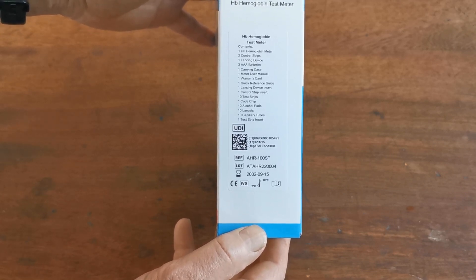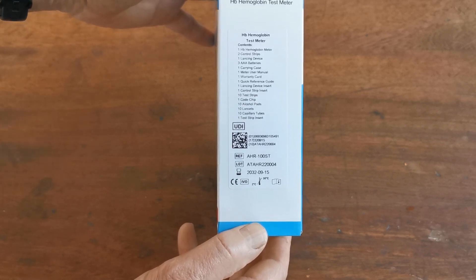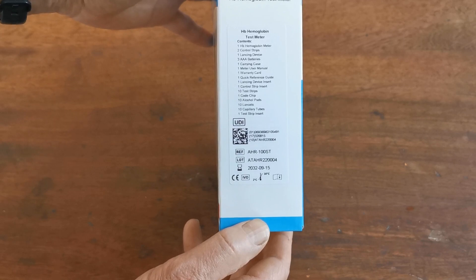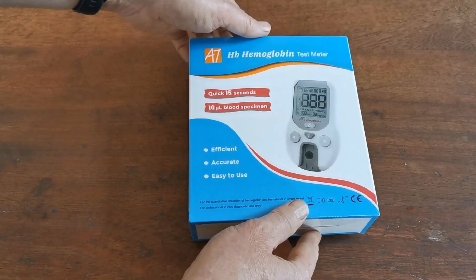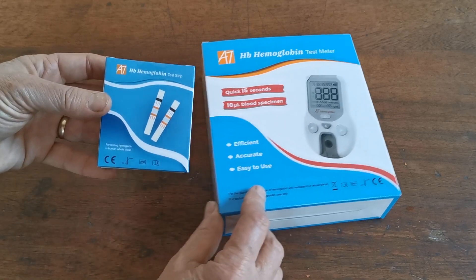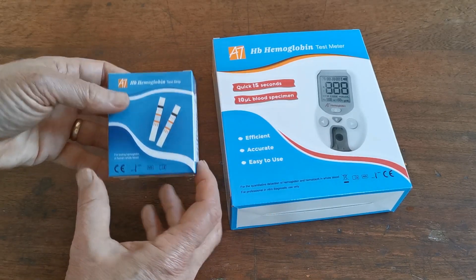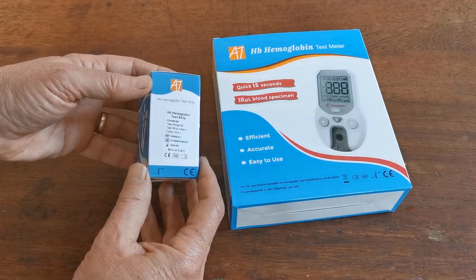You get test strips — 10 of them — 10 lancets, the code chips, some alcohol pads, lancets, capillary tubes, and some test strip inserts. Also available from us, but sold separately, are the refill packs of test strips: AllTest Hb haemoglobin test strips, in a pack containing 50 test strips.